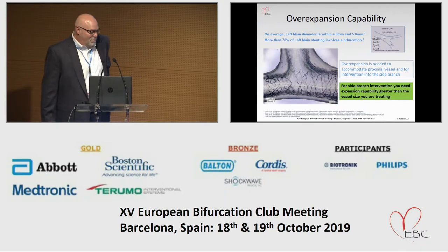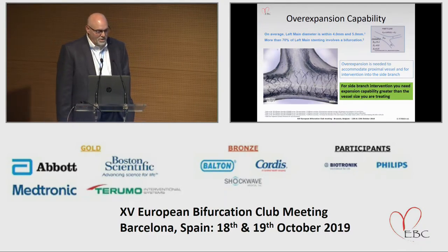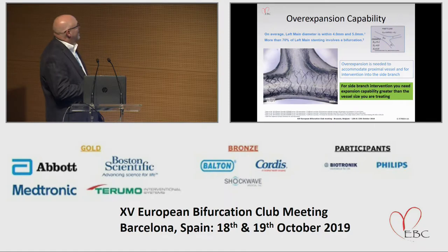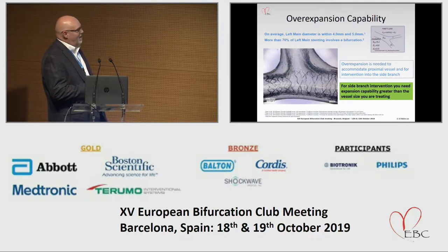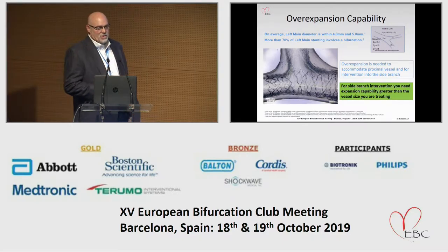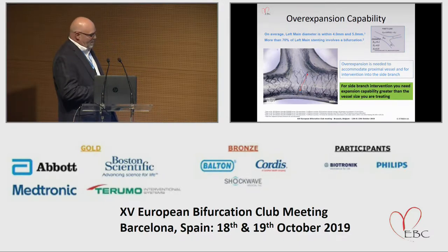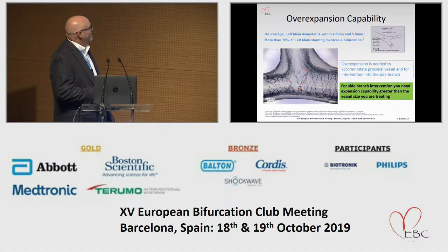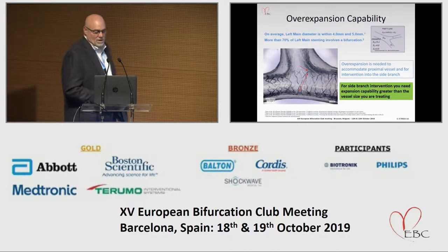Let's get started. Overexpansion capability. This is a very important feature in a stent. As you can see in this diagram, you have large changes between the distal vessel and the proximal vessel. And you can see, although a stent was chosen that can accommodate both the distal vessel and the proximal vessel, once you place a balloon through this side cell and dilate, struts get pushed, pulled, and moved in very unique ways. And you can see now this particular row of struts has been completely maxed out. It cannot stretch any further, leaving behind a small resulting area of malapposition.